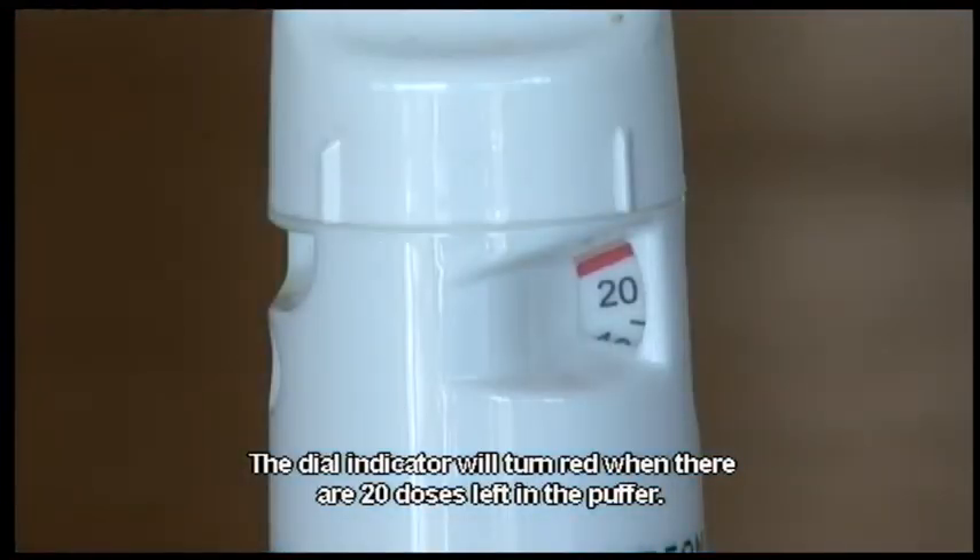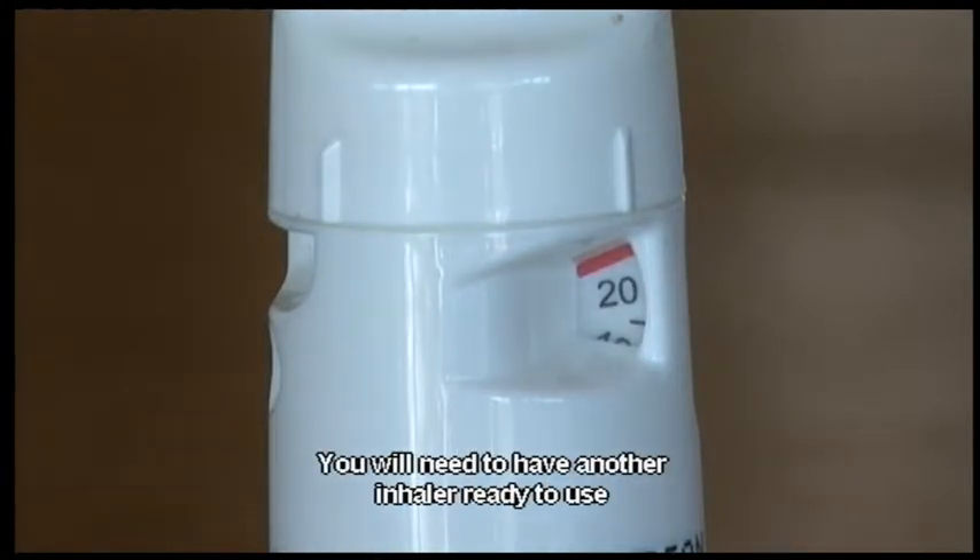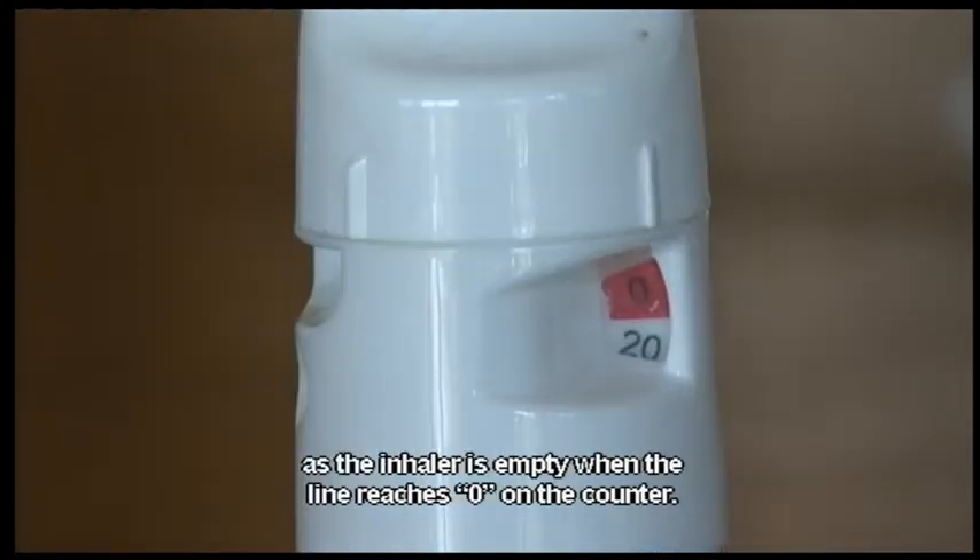The dial indicator will turn red when there are 20 doses left in the puffer. You will need to have another inhaler ready to use, as the inhaler is empty when the line reaches zero on the counter.